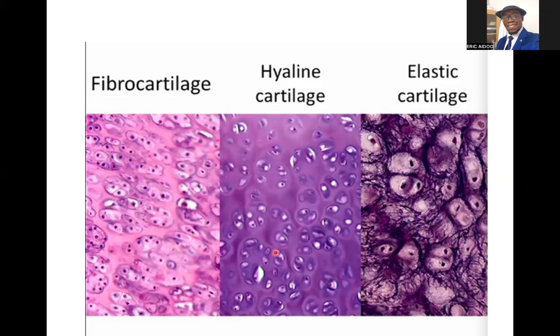And for hyaline cartilage, they are usually concentrated in the middle, and then they are grouped together. So they form isogenous groups. So either two like that or three, grouped together, or even more than three. You can have 4, 5, or 6 grouped together, forming isogenous groups. And the background is not too noisy, okay? It's quite flexible and continuous and then uniform.